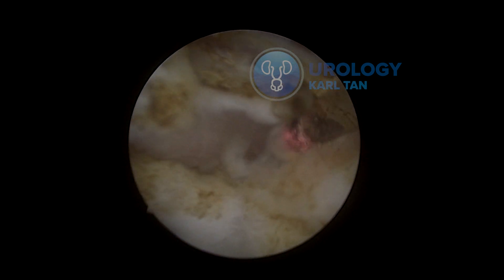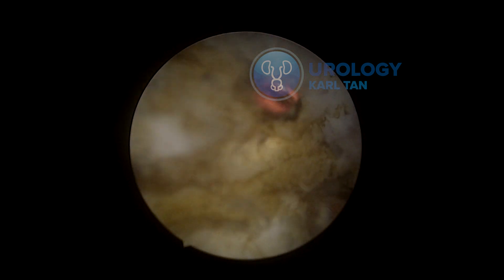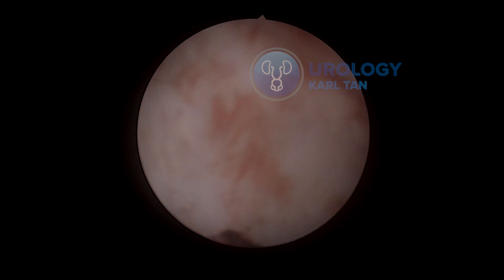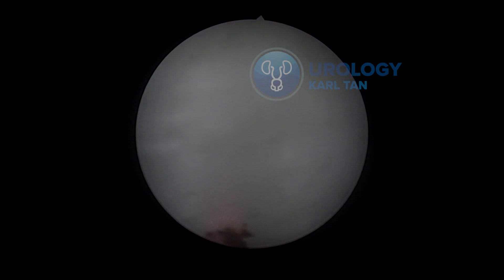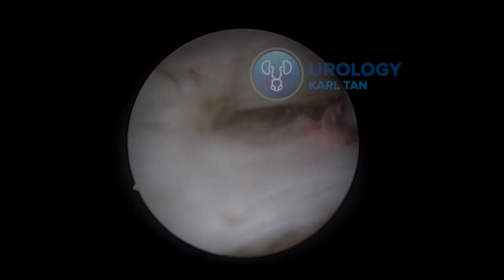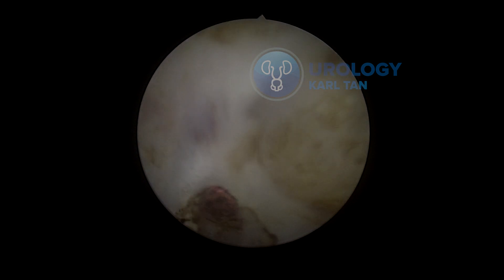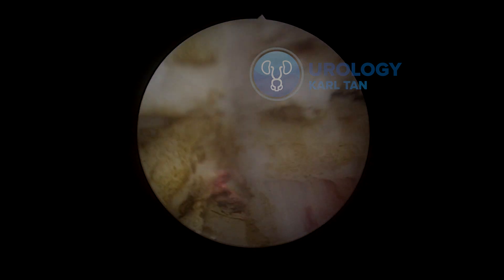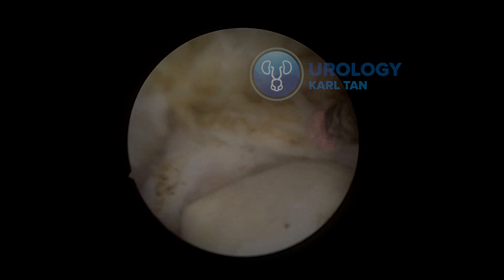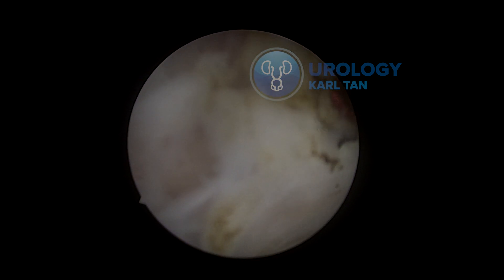This technique is quite special because it's like a template I can use when I need to do an en bloc enucleation. Basically my go-to technique would be an en bloc enucleation. If it's too big and I cannot push it into the bladder, I would do a two-lobe technique, and if it's a giant prostate that doesn't fit inside the bladder, I would do a three-lobe technique.